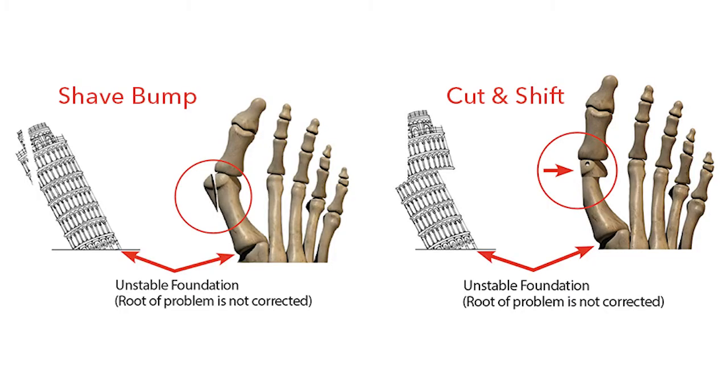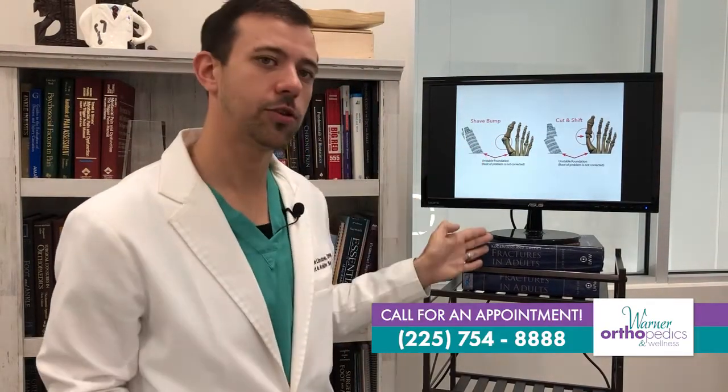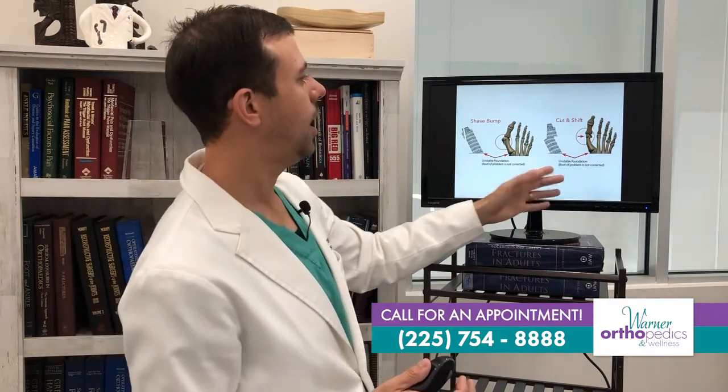The problem with doing that is that creates an unstable foundation. You are creating abnormal anatomy by doing that. If you're not treating the root of the problem at the base of the metatarsal, your chances of a recurrence are much, much higher. Okay, so again, this is a simple bumpectomy where they just shave the bump off, and this is an Austin bunionectomy or distal metatarsal osteotomy, which is very, very common today.